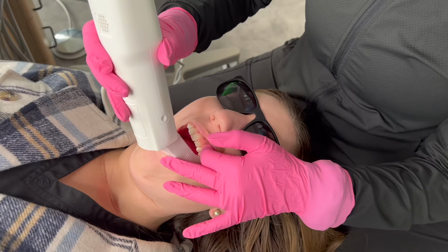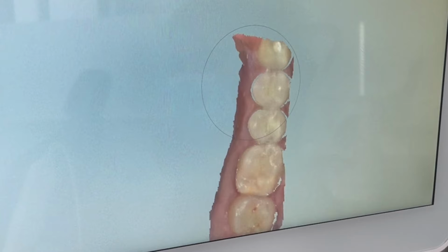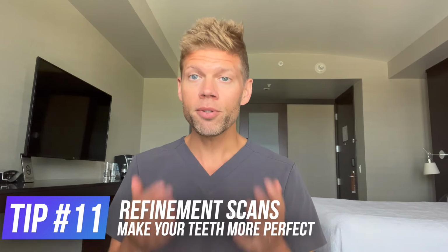When you're done with those initial trays you have, we actually plan to scan your mouth and make things more perfect. So we end up ordering more aligners for you. Sometimes it takes 2 refinements, sometimes it's 4 to 5 refinements. When you do refinements, it may take a few weeks to get your aligners in, and so you do need to keep your teeth in the current position.